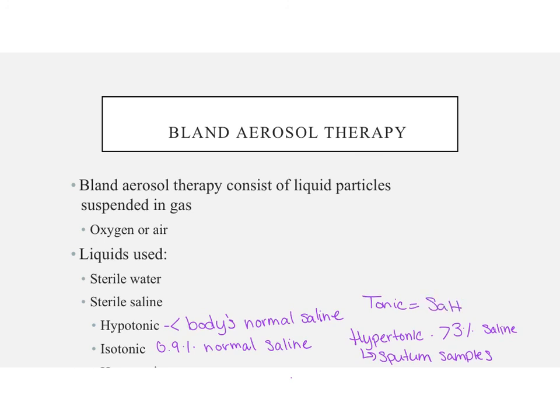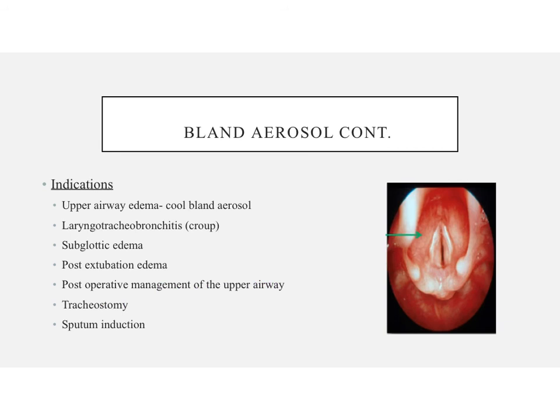So the difference between humidity and aerosol is, remember, humidity is water in the gas phase and aerosol is liquid particles suspended in gas. Bland aerosol therapy indications, so always know your indications. Bland aerosol therapy can often be called cool mist or cool bland aerosol. They are all interchangeable.